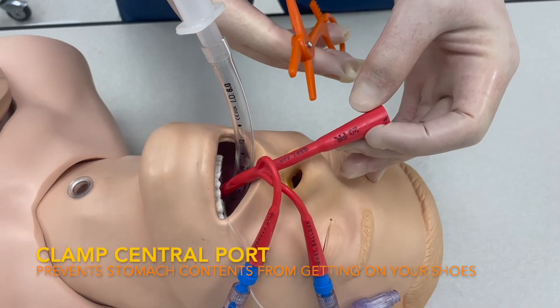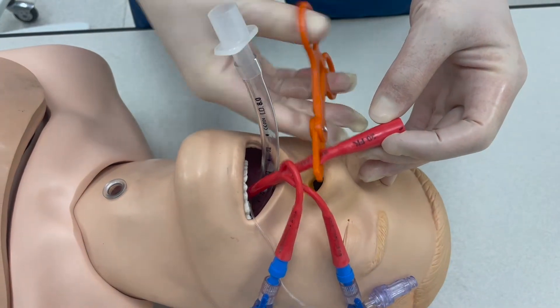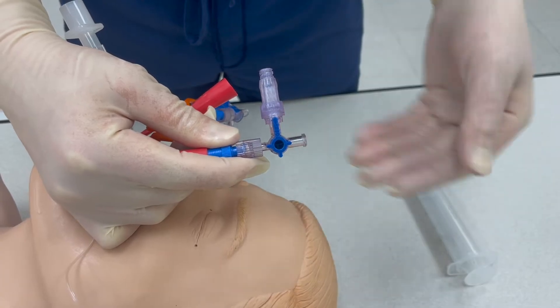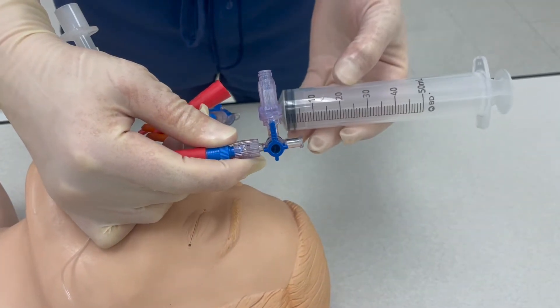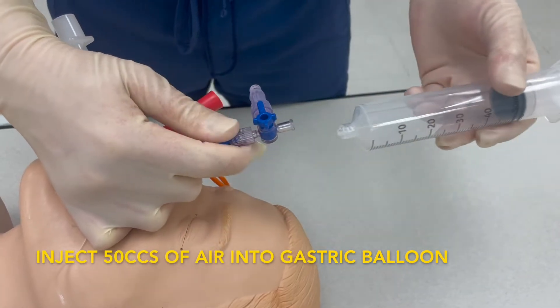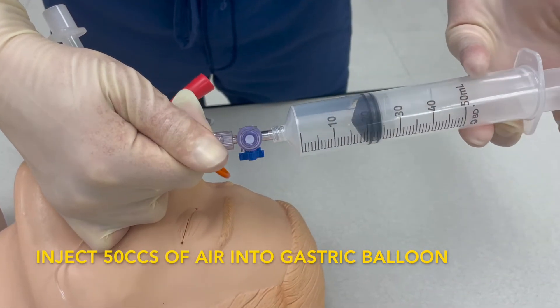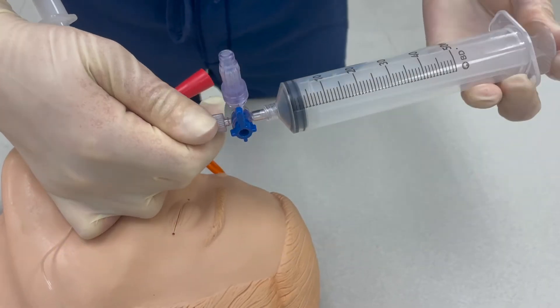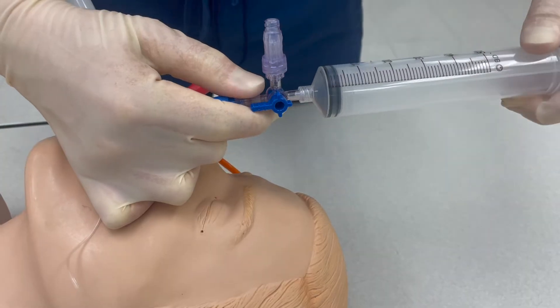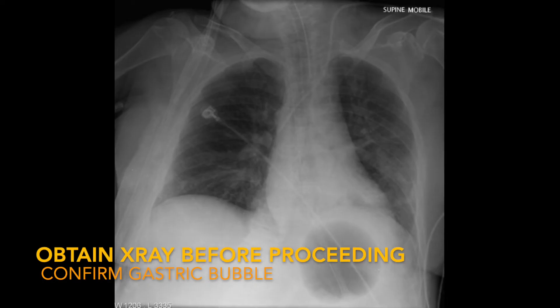After removing the Dobhof wire, be ready to clamp the gastric aspiration port. Reposition your three-way stopcock valve to allow for inline airflow. Take your 50 cc syringe and inject 50 cc's of air into the gastric balloon. Turn the valve so it is facing the Blakemore tube to prevent any air from leaking. Obtain an x-ray to confirm that the balloon is properly placed in the stomach.